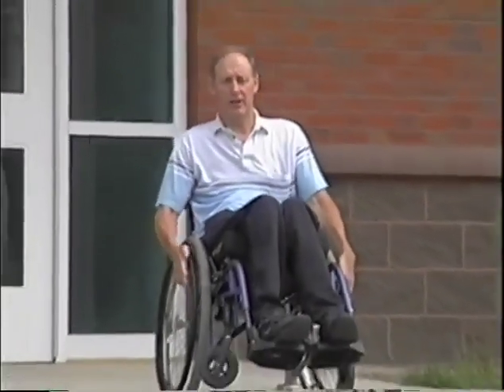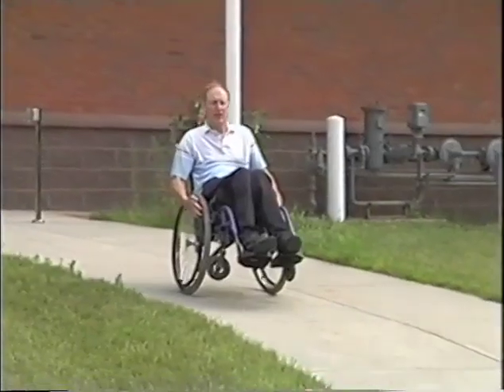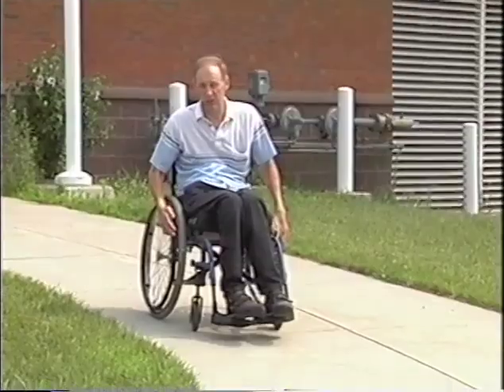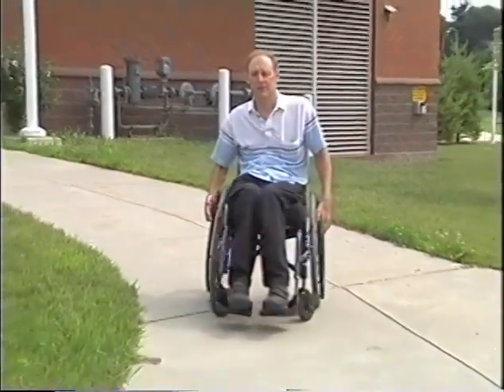One little skill you'll want to learn is to go down ramps in wheelies. This is very easy. The same skills of pulling wheelies apply here. You're getting the weight behind your axle, picking the chair up, and then letting it roll down the hill. Simply let the hand rim slide between your hands, and if you do start to fall over backwards, just stop the chair and the front end will come down. A very simple thing to learn, but very useful on rough terrain.